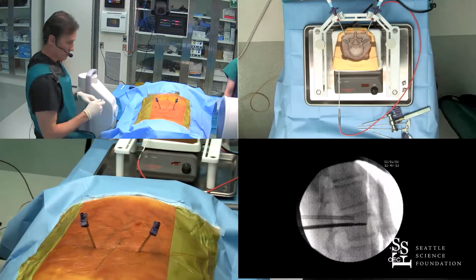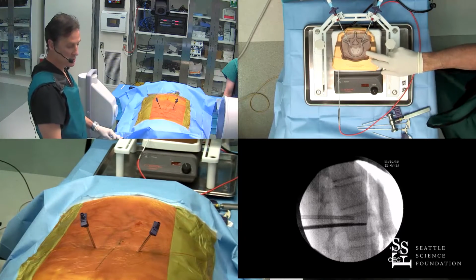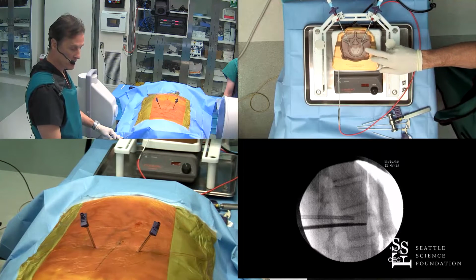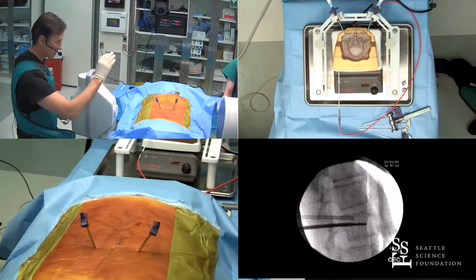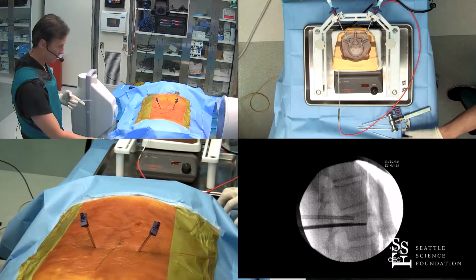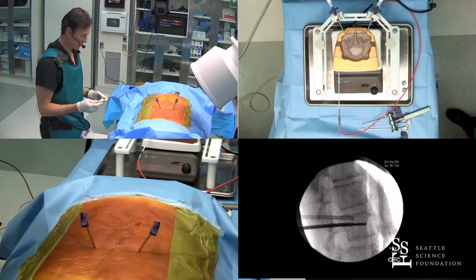So while we're ablating, I think we can probably see the ablation zones of the needle still running. And the ablation zones are elliptical, and they join in the center. And they will continue to expand to encompass the whole of the vertebral body. Let's go ahead and let's come back around to AP. So this is a transpedicular approach.